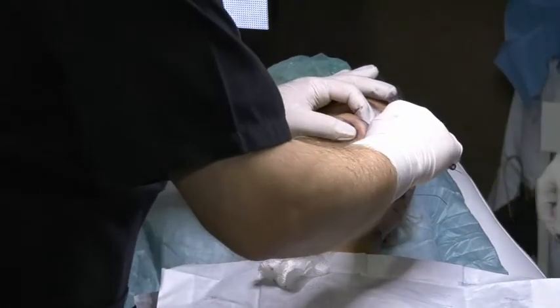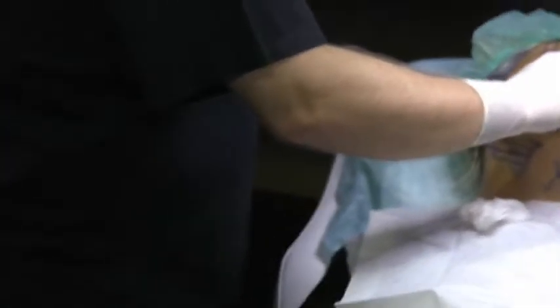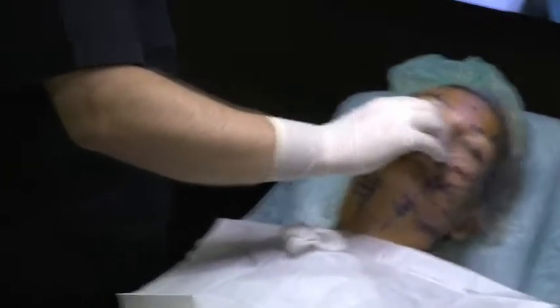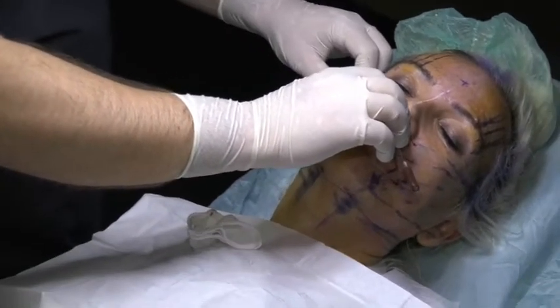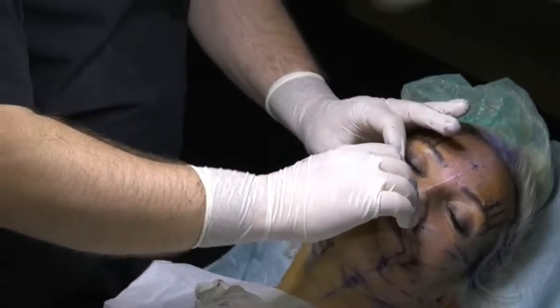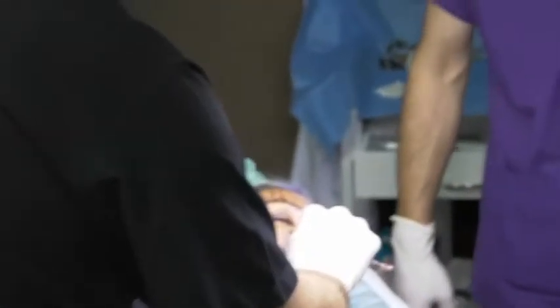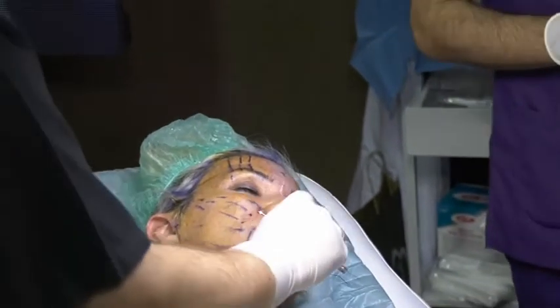And you should have a good angle, 20 to 30 to enter. Check, subcutaneous. Can you adjust? I don't know how to see. You see my hands now. They will not see the thread at all. I don't know what to do. Okay, I'll try to, okay, look.